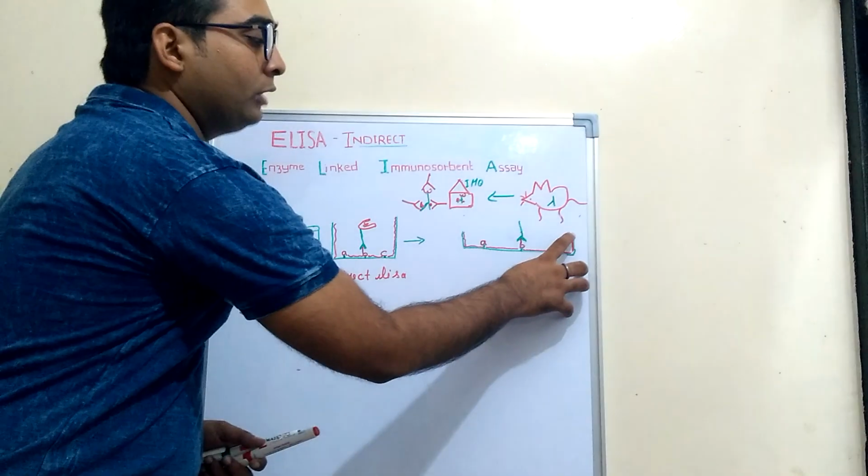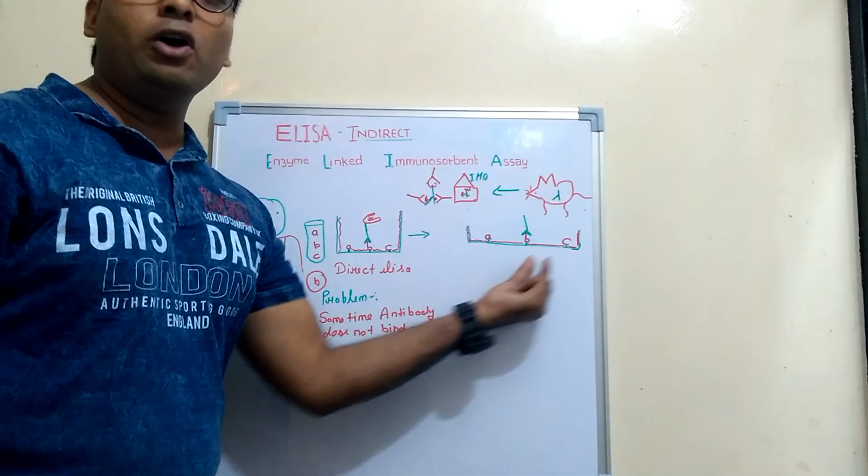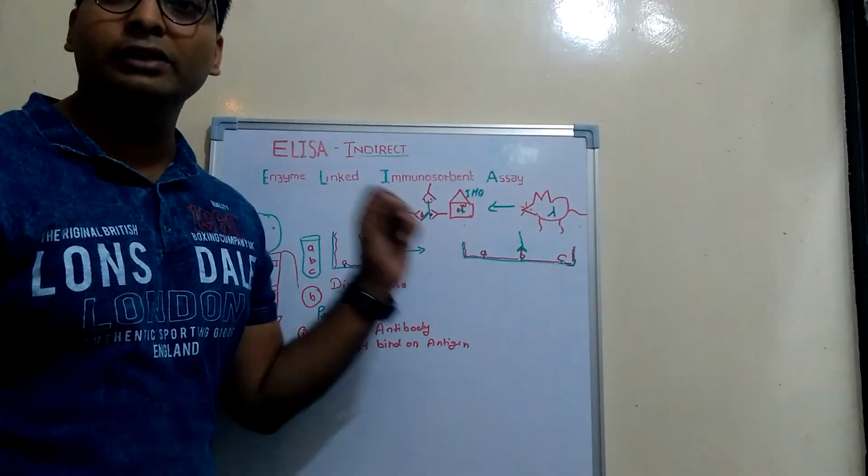Again, I will use the blocking reagent, because every vacant area, every free area will be blocked by the blocking reagent.